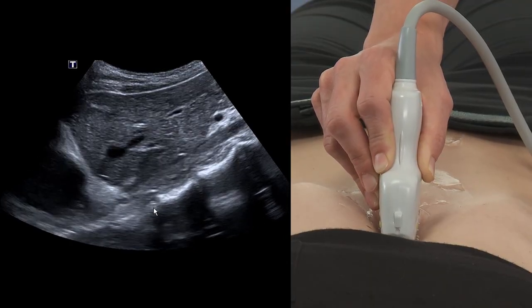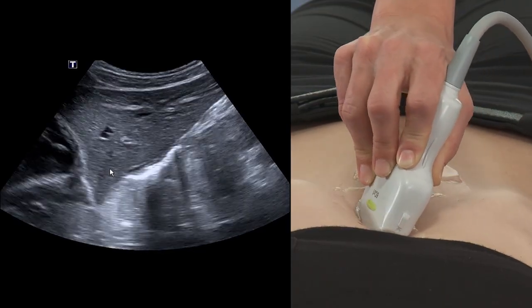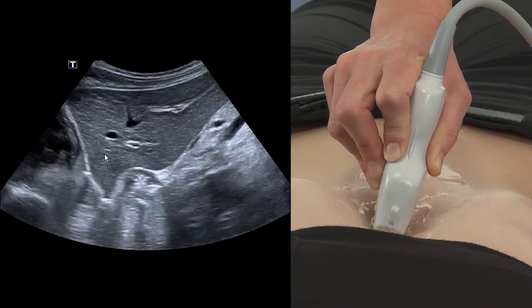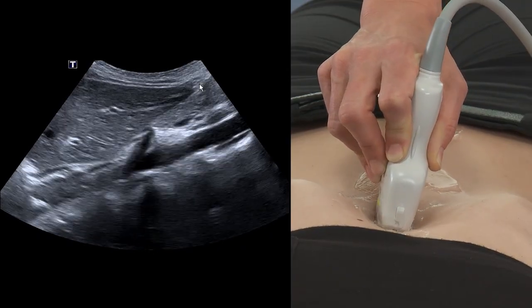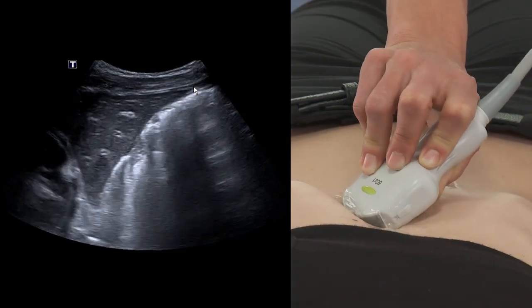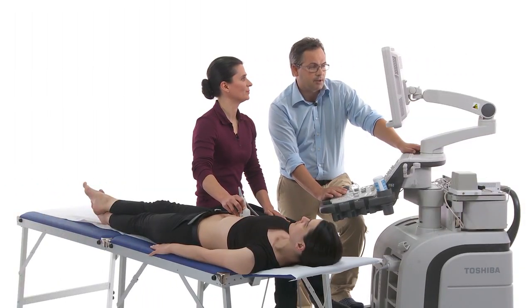So we ask our patient to inhale, please. Now I tilt my transducer to the left side of the patient. Get a picture of the left liver lobe. Perfect. And I perform this movement again, a little bit more caudally, so that I can have the caudal rim in my view also. Over here. And back to the midline again. Breathe normally, thank you. So we scanned the left liver lobe in the longitudinal scan.